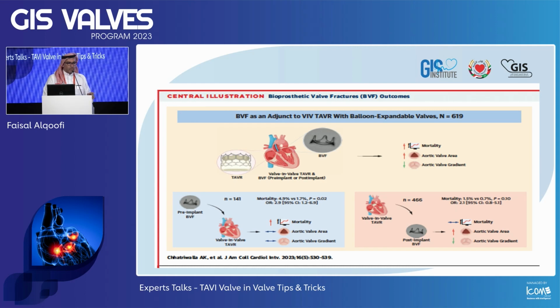Now, I also want to emphasize that in general, when you are dealing with a valve-in-valve for the aortic position, defining success is very important in terms of hemodynamics and patient age, because some of those patients, when they present at a younger age, can still be surgical candidates. The second part, which is very relevant to our area, is the sizes of valve that we are dealing with.